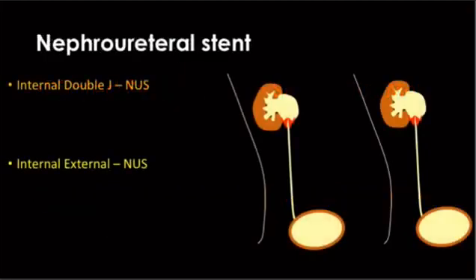and then everything is the same after that. So nephroureteral stents are the ideal endpoint for somebody that's requiring more permanent placement of a nephrostomy tube. Why, you might say? Well, I should back up and say there are external nephroureteral stents, which is basically a situation where you've got a blockage like here, and then you place your nephrostomy tube with a stent all the way down into the bladder, and then you've got a bag hanging outside of the patient, and that sucks. Terrible quality of life. You've got a bag of urine strapped to your back, and the tube is super uncomfortable and painful, jiggling around out there, laying on it, that kind of stuff.